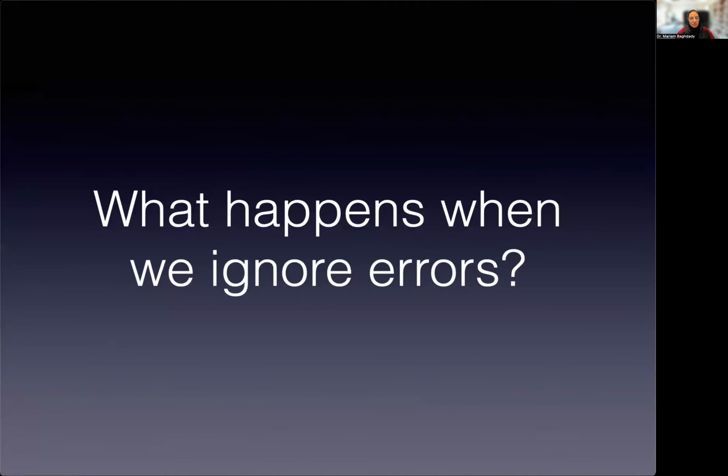Okay, so before we get into the interactive part where we're really going to understand things, what happens when we ignore errors? I know that a lot of people think that I'm very, very strict when it comes to avoiding errors. People think I'm a little bit too strict when it comes to metal artifact and earrings, and I've had complaints from doctors, I've had complaints from patients, and everyone says, "Oh, I've done this 100 times and no one asked me to take off my earrings. Why are you asking?" It's because of what I've seen.